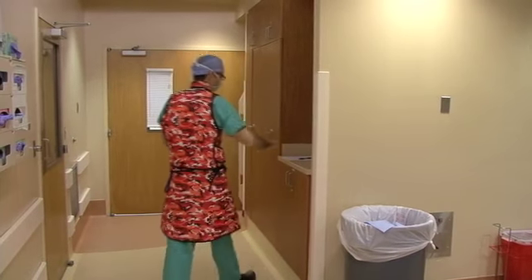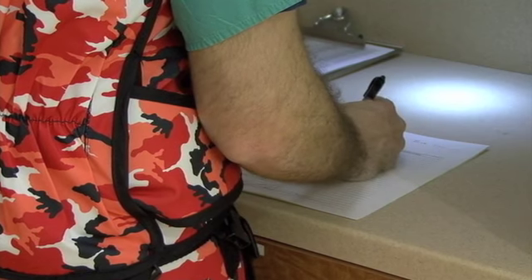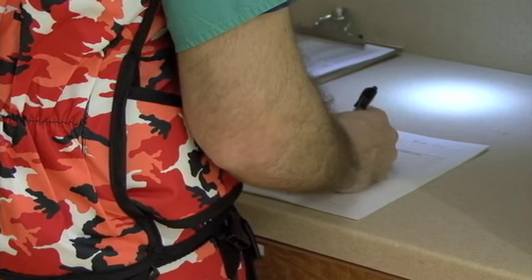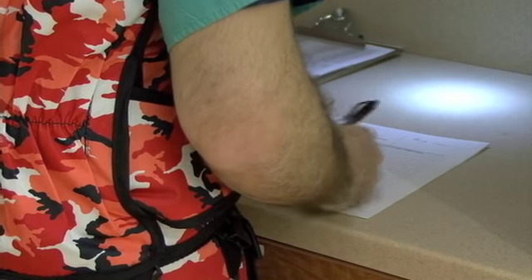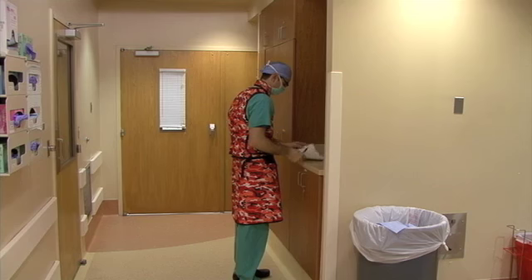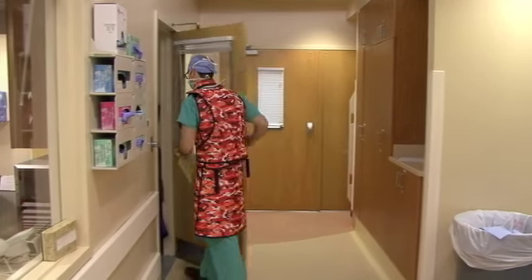When you finish with your procedure, you will fill out a procedure note. You will keep the bottom yellow carbon copy to dictate from. If you are scrubbed for a procedure, it is expected that you will attempt the dictation unless the attending says otherwise. You will also sign the nurse's order sheet for the meds that were given for sedation during the procedure. Now that we're done with the procedure, we'll take off our lead and head back to the reading room.